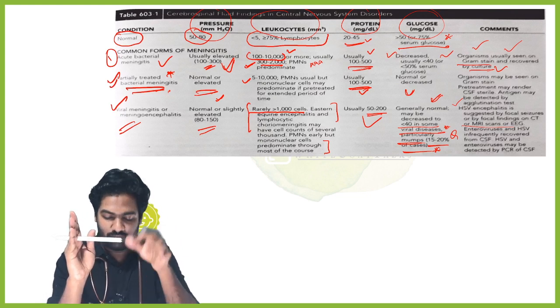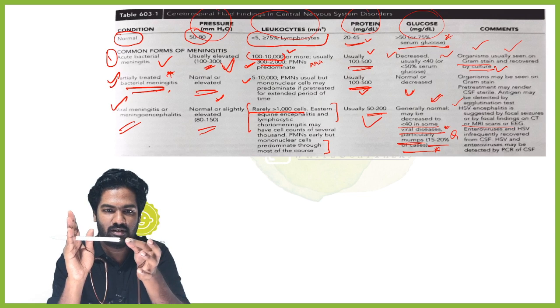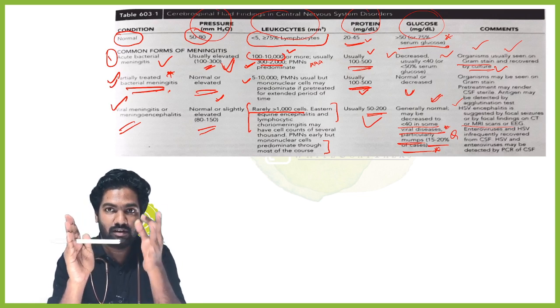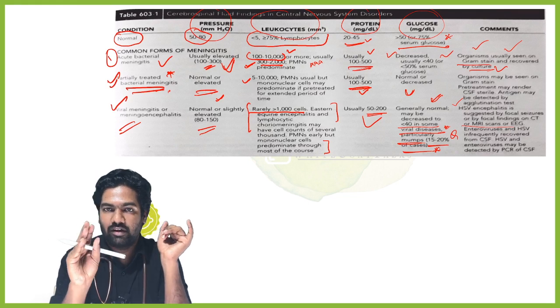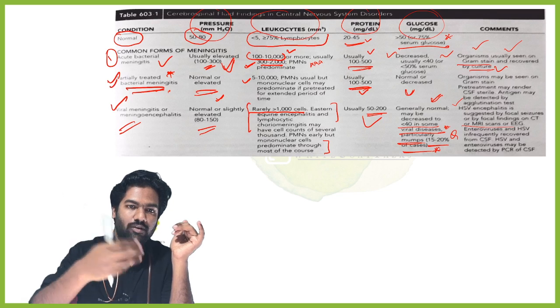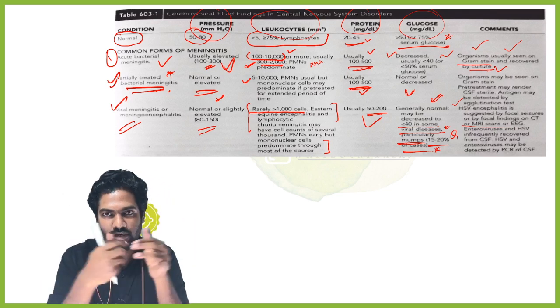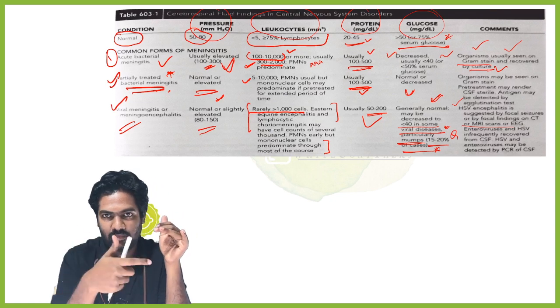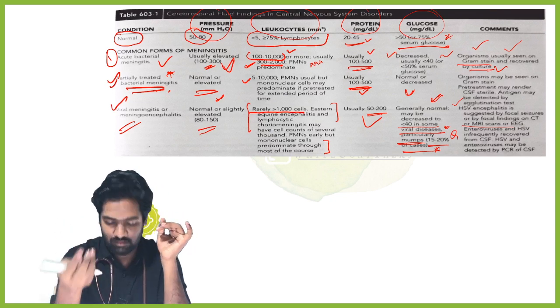To know the pressures, a special manometer is connected at this end, and that decides the opening pressure. Based on that, if the pressures are very elevated, we usually see the CSF spurts out like a sprinkle.